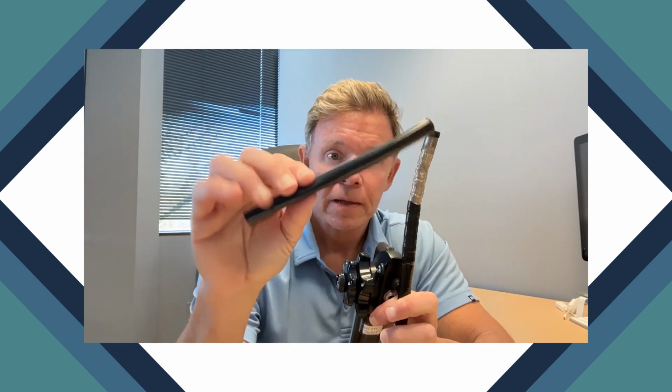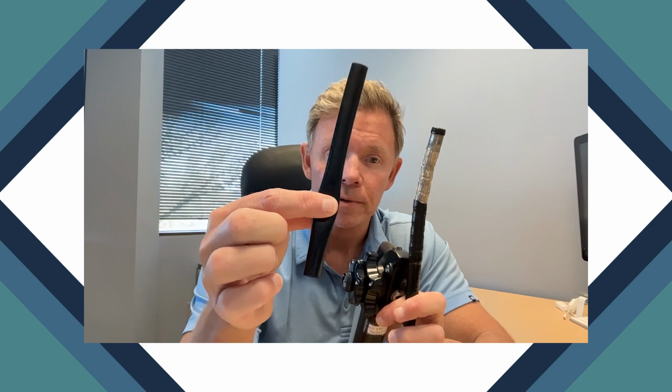I'm going to go back to the distal tip here again with you, Chyrill. So when you pick up a scope in the field, I mentioned earlier that a portion of this is already taken apart. This is what we call the bending rubber. The bending rubber is a thin rubber material, and it covers the outer 5 or 6 inches of the scope. So when you pick up the scope in the field, you're not going to see the silver colored distal end here. That's going to be covered by this sheath, just like you see here.